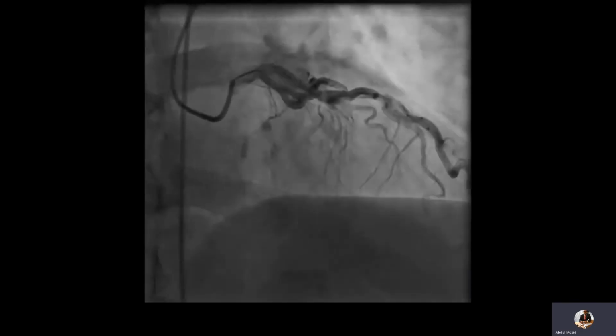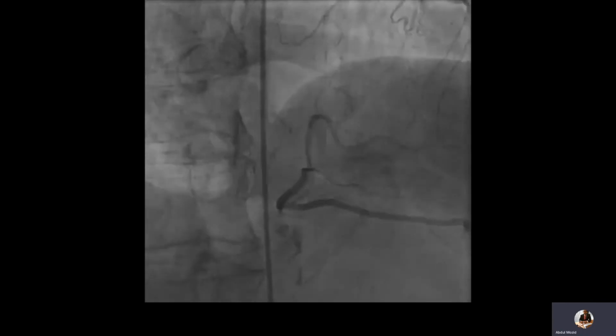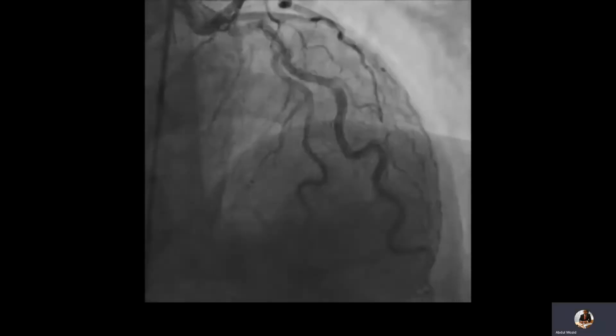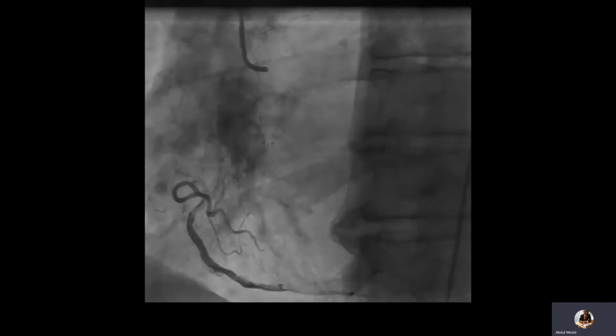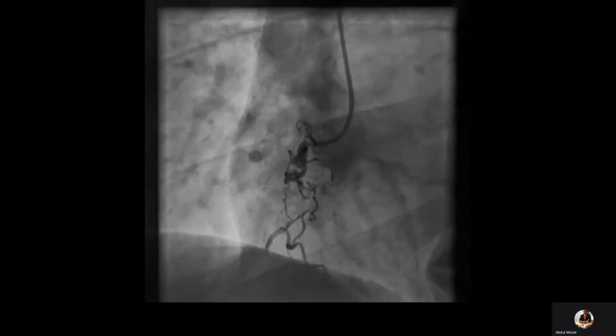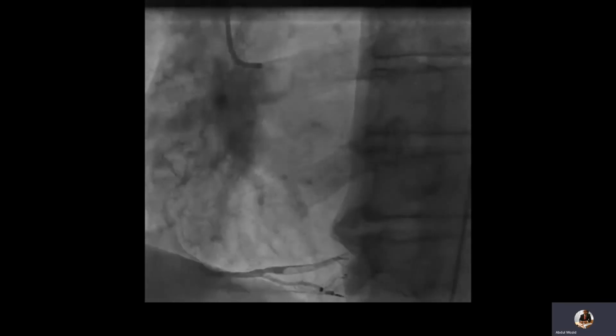This is the diagnostic angiogram from the most recent diagnostic procedure, showing the large dominant epicardial collateral from a large diagonal system, possibly some septals. This is the right coronary occlusion, which appears a proximal occlusion, calcified vessel, and fairly ambiguous course in the mid vessel, although the cap is reasonably well defined.